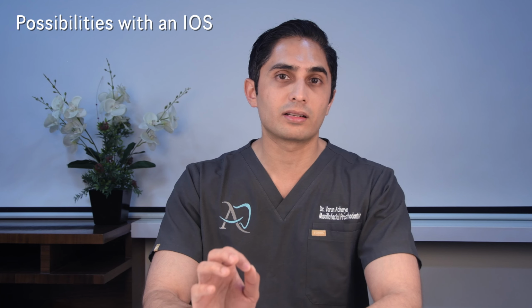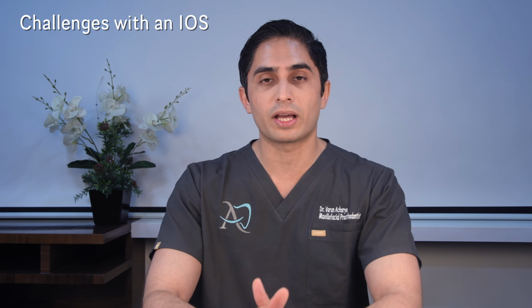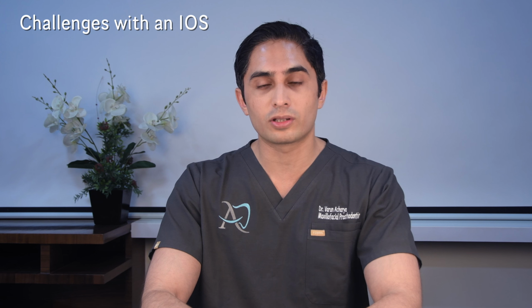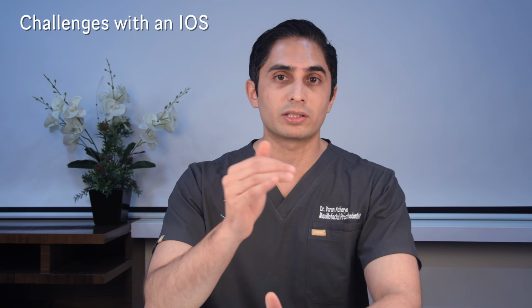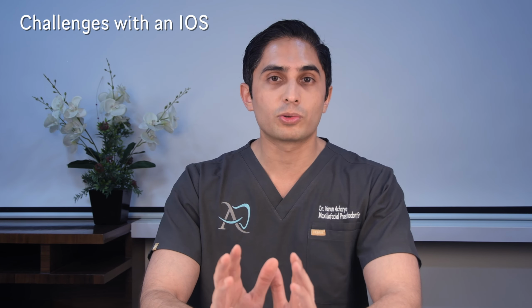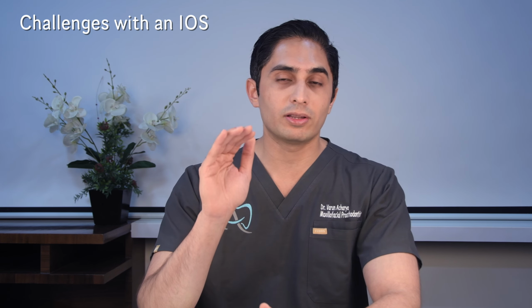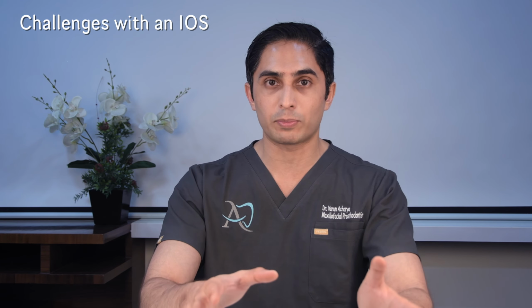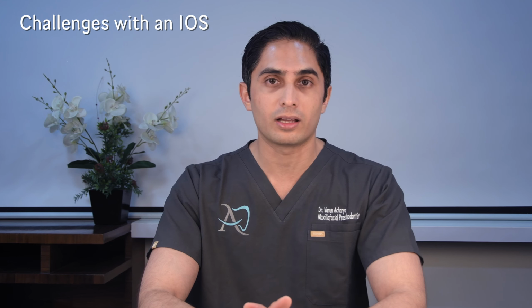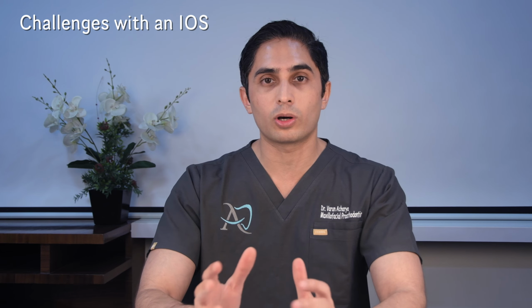Now, where things get a little bit challenging is when your margins become subgingival. And we see it a lot, right? Someone who's had food impaction between two molars for the longest time, and now they've undergone a root canal treatment, and now they need a crown placed, but that margin is really quite subgingival. So now to capture that effectively with any scanner is going to be challenging, because even though it might look like you scanned that area perfectly fine and it looks fine on your laptop or on your device which you're using for the scanning, when it ends up on the lab side, and we get to see this because we do all of our lab cases in-house.